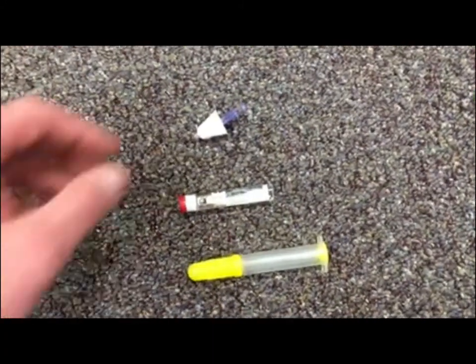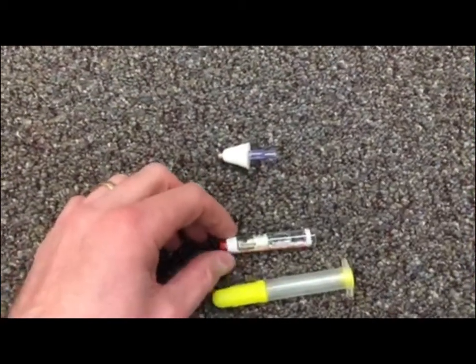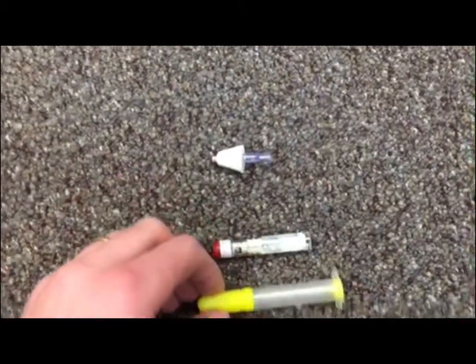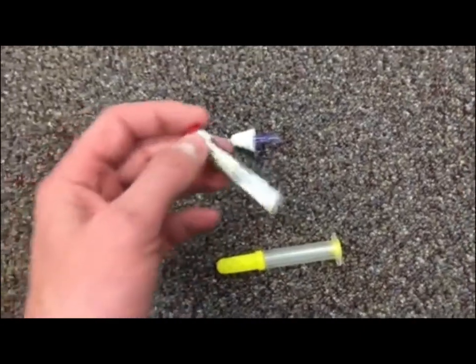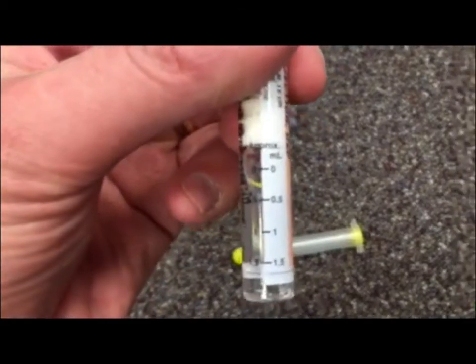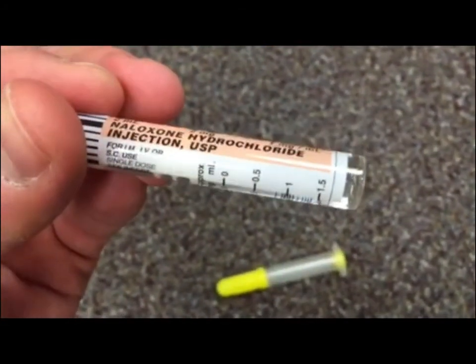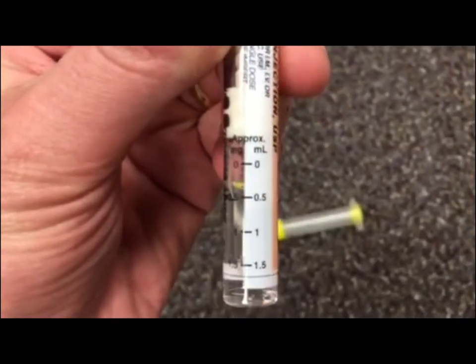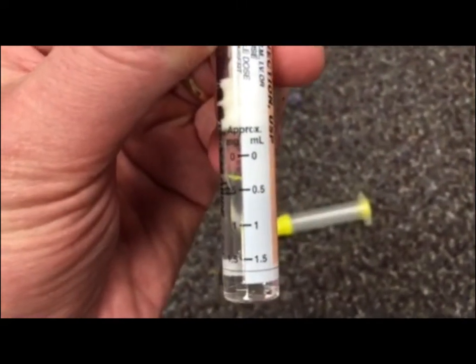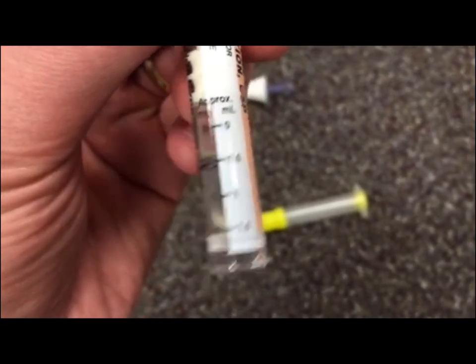All right, so once we've opened the packaging, we see we have our MAD device right here. Inside the box, you have these two devices for the Narcan. Here we have a glass vial that contains our medication. You see it's marked on the side, naloxone hydrochloride for injection. And we have some markings on the side that indicate how much 1 milliliter would be to inject. We see we have one clearly marked on there.